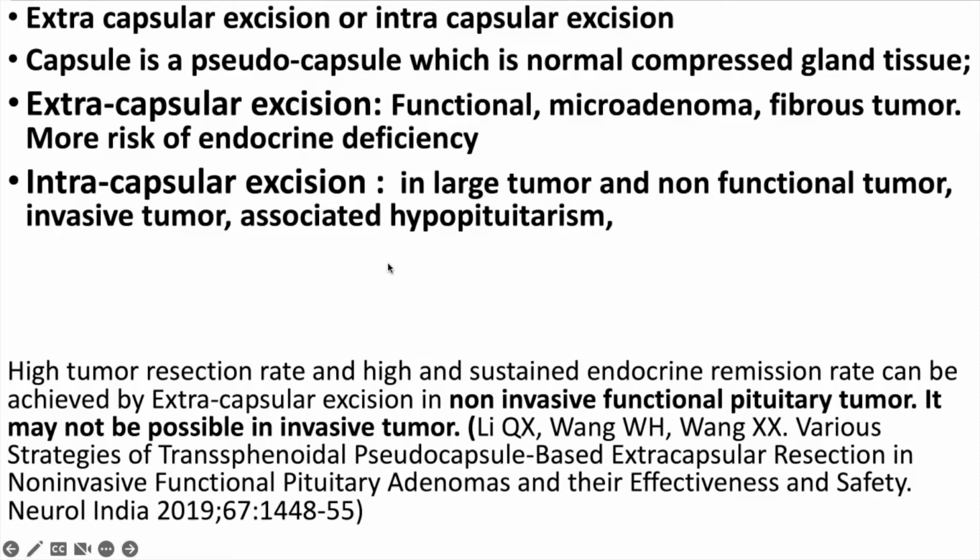Intracapsular excision is performed when there's a large lesion, so go for internal decompression, non-functional tumors, invasive tumors, and especially if the patient is already having hypopituitarism. So try and keep the pseudocapsule intact, because that is also a normal pituitary gland.